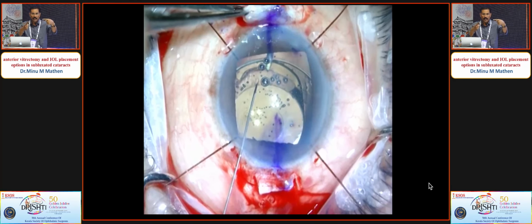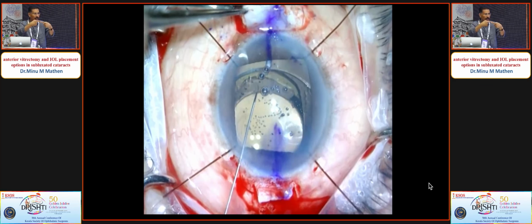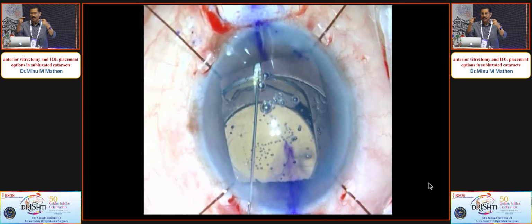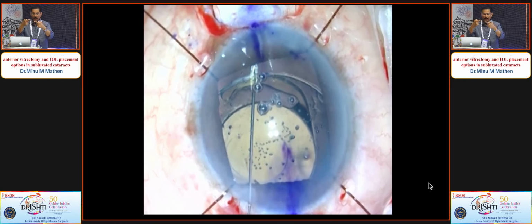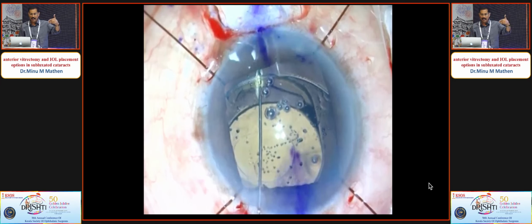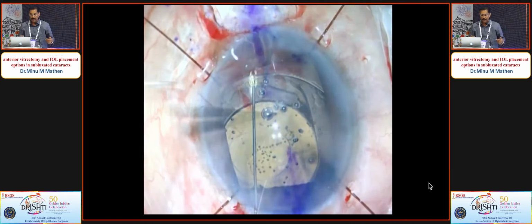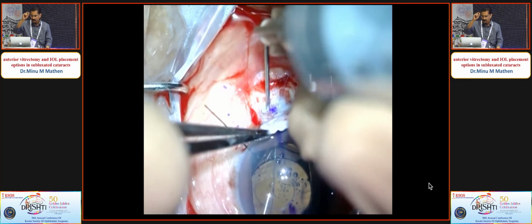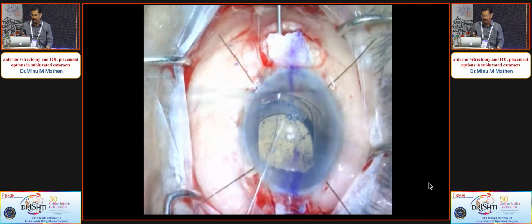After entering both needles inside, you will realize that the Prolene needle is not going into the hollow of the needle. So make sure that your Prolene needle will go into that first outside, then do this. And the needle is placed behind the complex, and the Prolene needle pierces the bag and comes out, and the same thing is repeated on the other side.